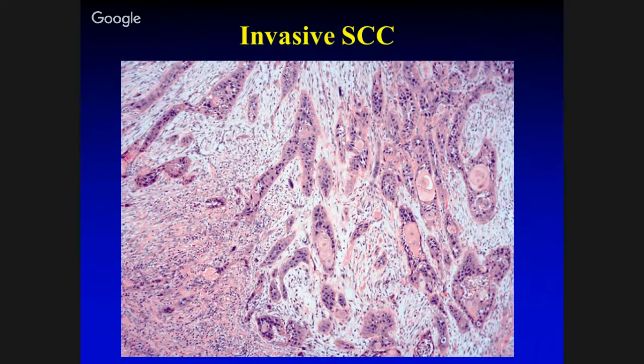What about HPV cancers and EBV cancers? When they invade, do they do the same thing? Excuse me? Very more inflammation, right? Well, there's often not a host response. So that's why you may see an overrun of inflammatory cells, but no desmoplasia. So I'll show you some examples if we get that.